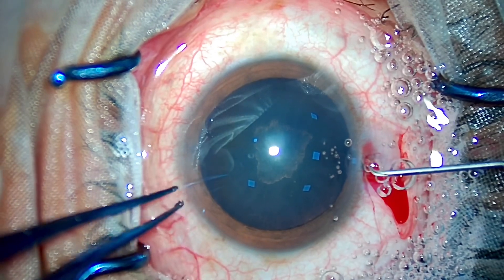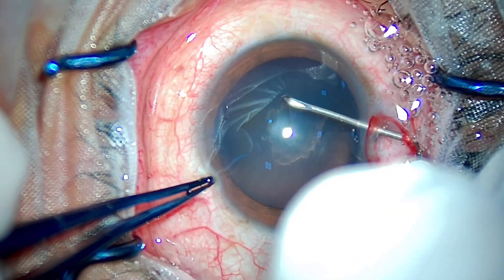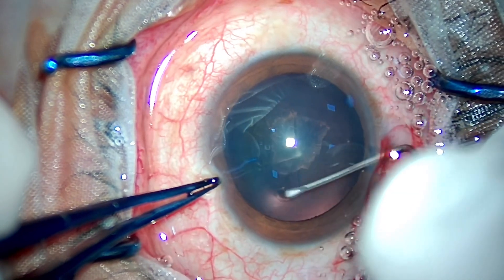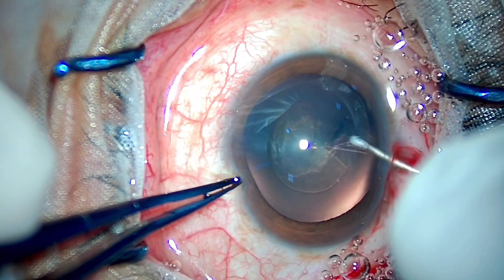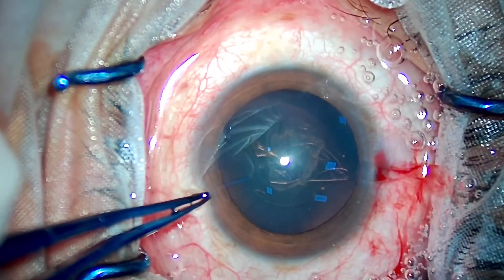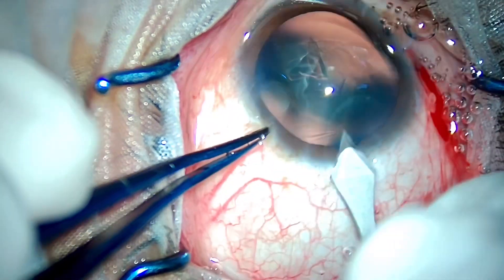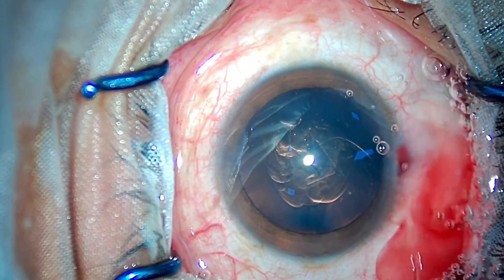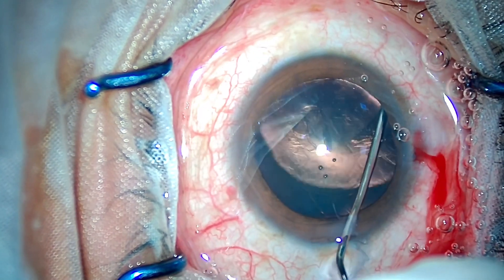Key number one: as I am implanting a Synergy IOL, we need to center it perfectly. This patient is 50 years old and I need to implant a beautiful IOL so that it lasts the natural lifespan of the patient. I have deliberately made a rhexis that is 4.5 to 5 mm in diameter, which should overlap the IOL 360 degrees, preventing the migration of anterior capsular stem cells to the posterior capsule, which cause PCO in the long term.